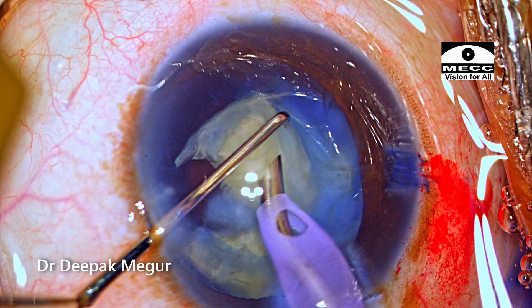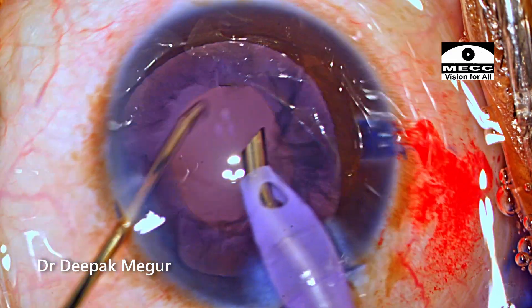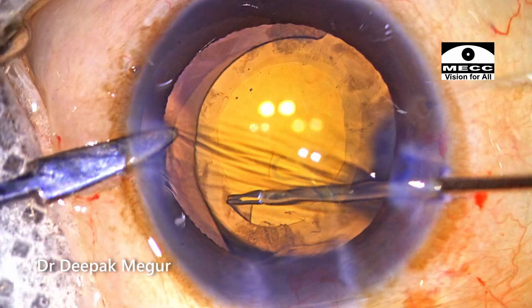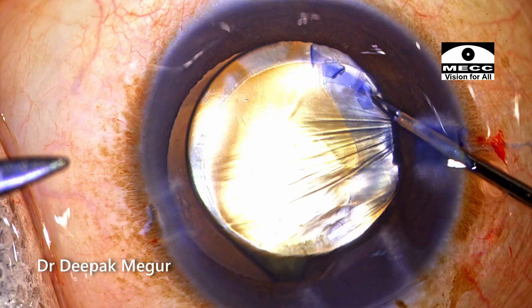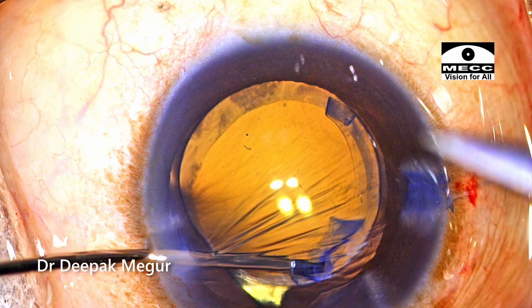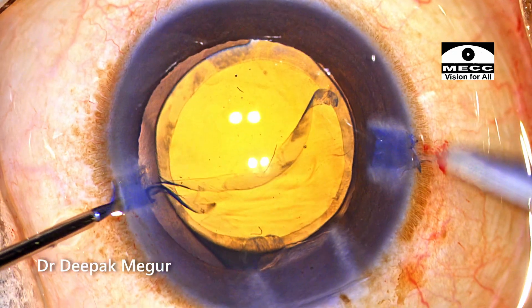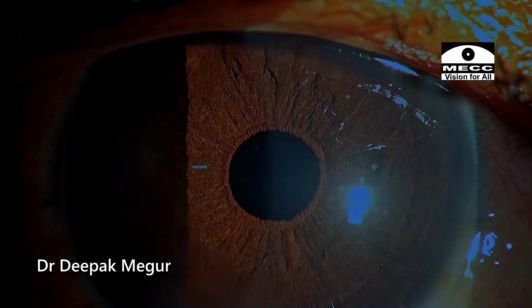The nucleus was relatively soft, so division and emulsification were not at all an issue. The lens is now being implanted. Time to enlarge the rhexis — a tangential cut is given using micro scissors, then the thin flap is grasped with the forceps and the rhexis is enlarged. A similar thing is done in the other quadrant as well. Phacoemulsification through a very small rhexis could be done very safely by following certain basic principles. The rhexis was then enlarged to the appropriate size after implantation of the lens. This is how the eye looked at the end of the case, and these are the first-day pictures.